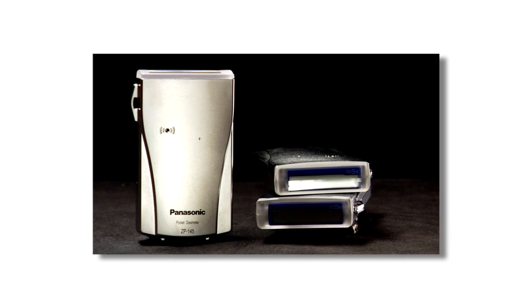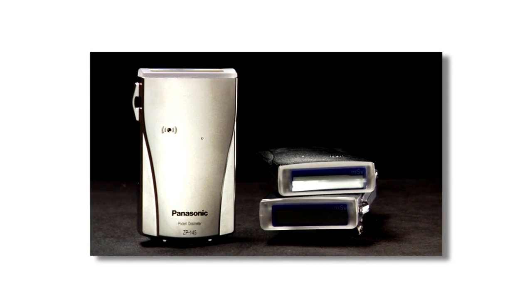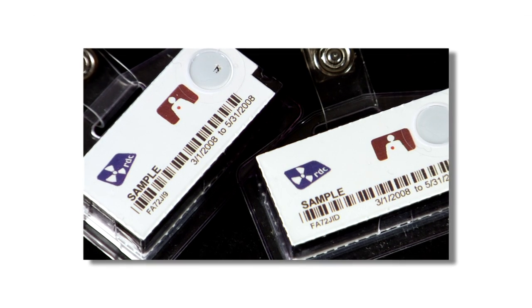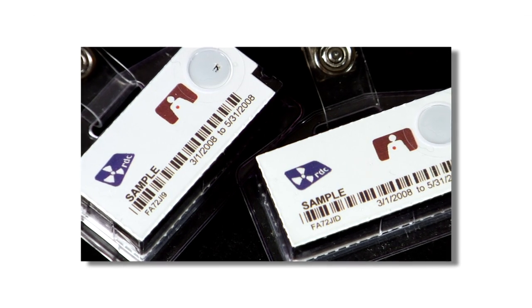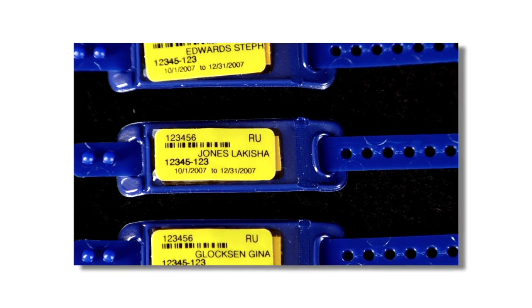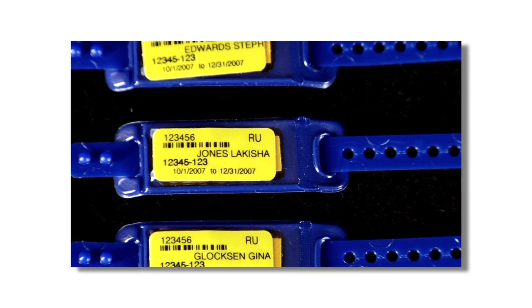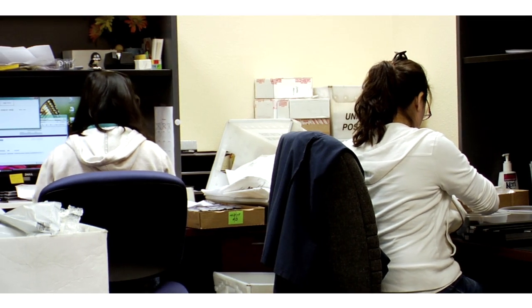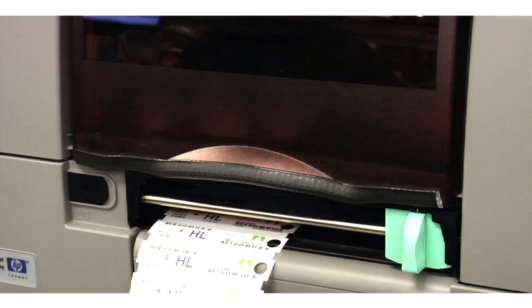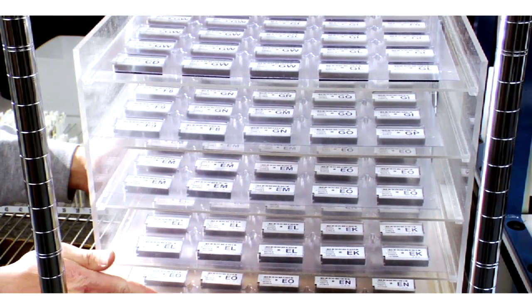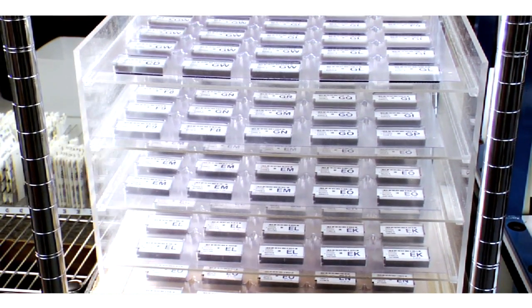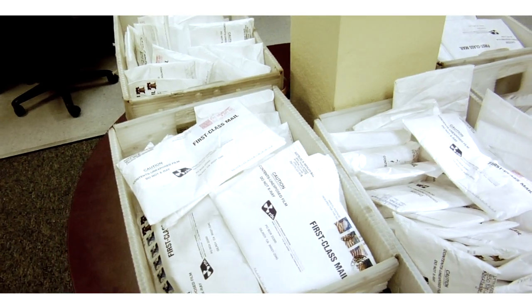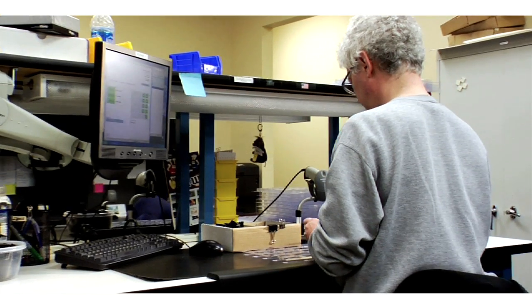RDC offers a full range of thermoluminescent dosimetry or TLD products and services to monitor radiation exposure. The badges ordered by customers are assembled and shipped here. At RDC, we believe every customer deserves a brand new badge every time.